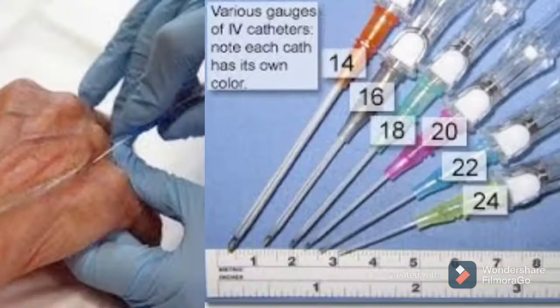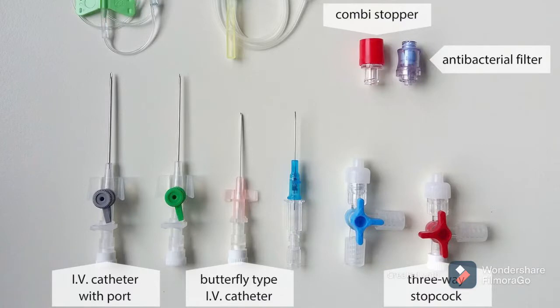Hi everyone, welcome to Nursing with CG. In this video you're going to learn about how to place an IV. The first step is the selection of the catheter, which is based on the patient's age, size, and the purpose of the placement.